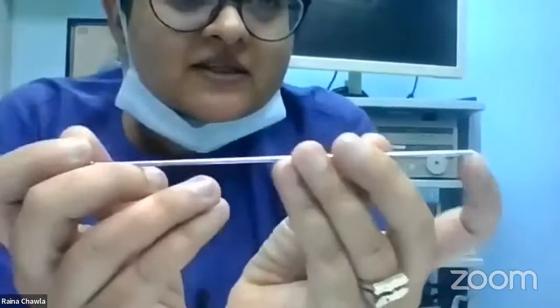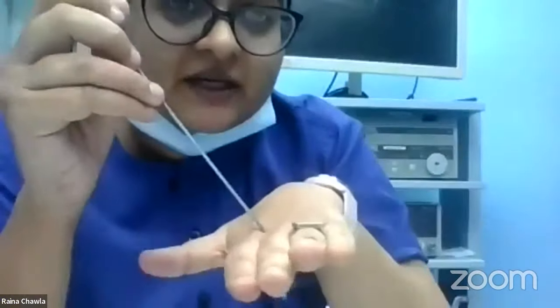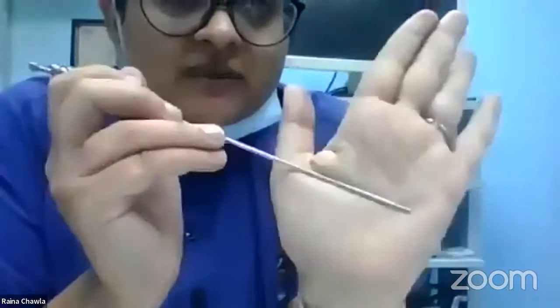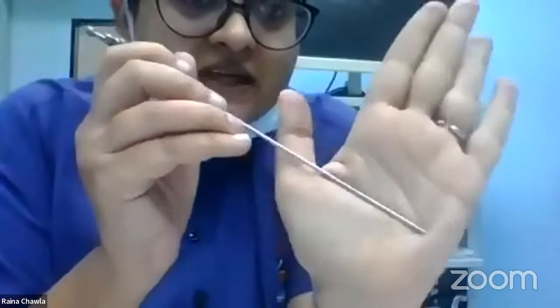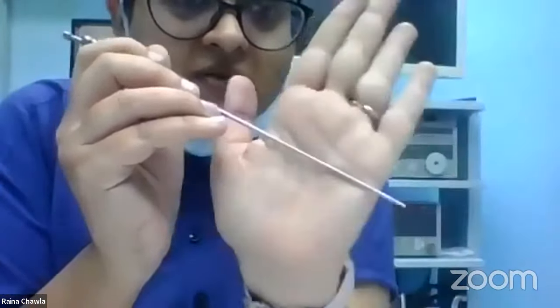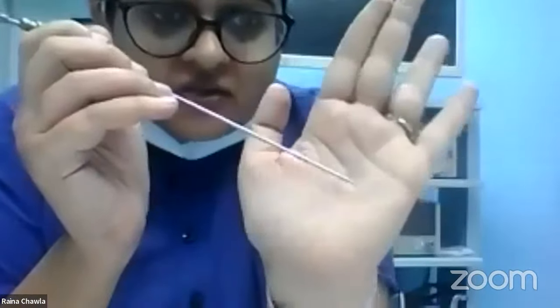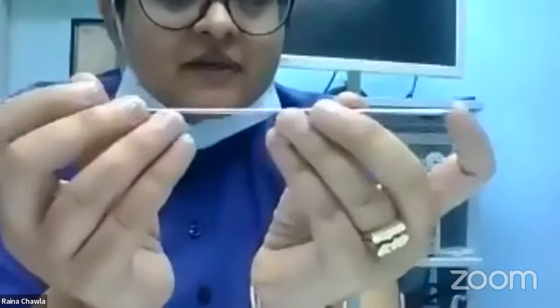Very important is the mechanism, the two ends here. You can see there's a blunt end and when I push it in, the sharp end is there. So this is a safety mechanism. You can see the blunt end is here when I push. However, the sharp end is there. And once it enters the cavity, the blunt end avoids inadvertent injury to the bowel or any other structure, such as a vascular structure, which may get injured. So it has a safety mechanism in place. Its entry is at 45 degrees, and you hear two clicks.